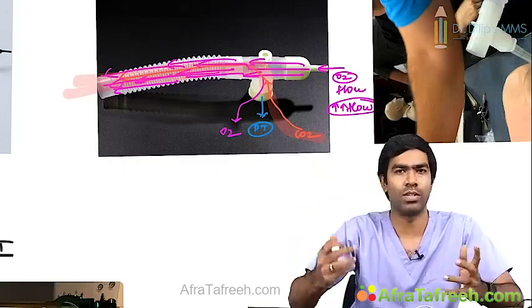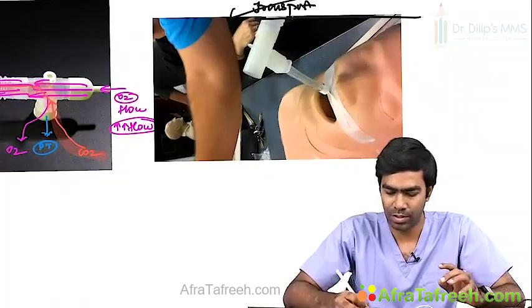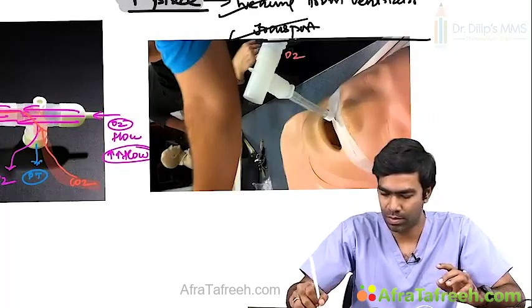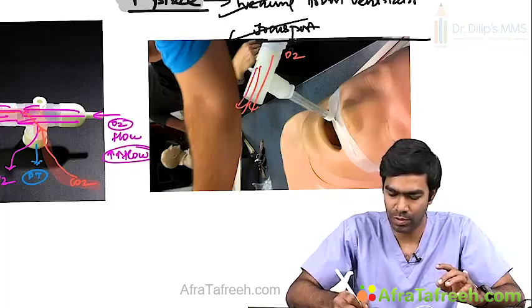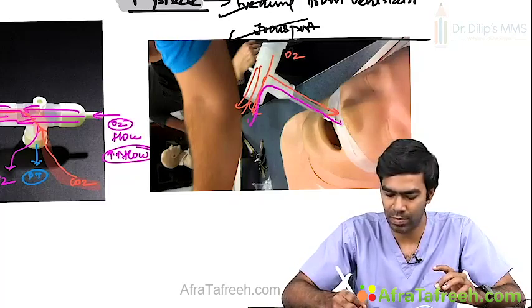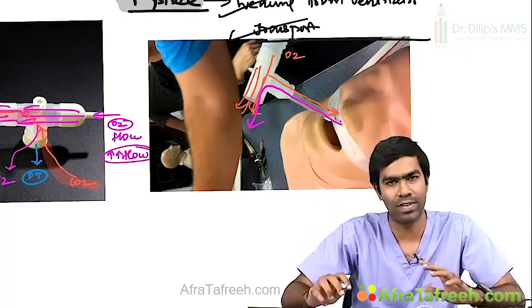So this is a very good thing. A very, very simple arrangement, a simple way of physics. You can see here, this is the area where oxygen comes from, and from this end there will be a very high flow moving here. The patient will be taking oxygen through this, and whatever exhaled gas the patient is releasing will be flushed out along with the high flows. These high flows will flush the carbon dioxide or exhaled gas out. So this is a very, very simple connection.